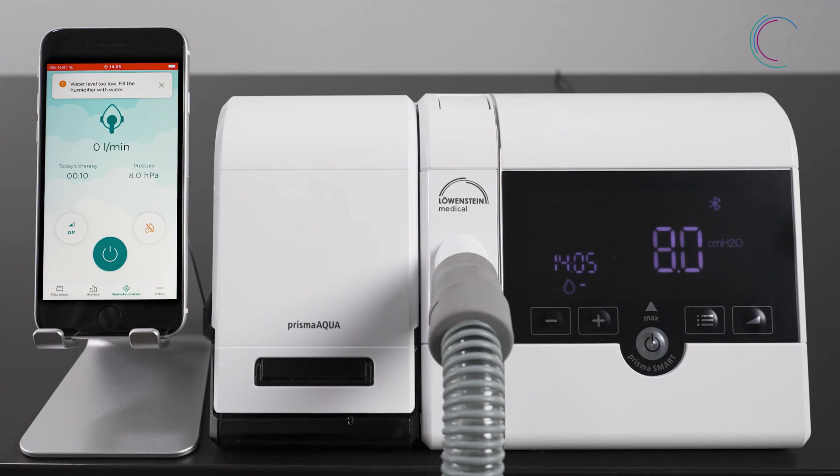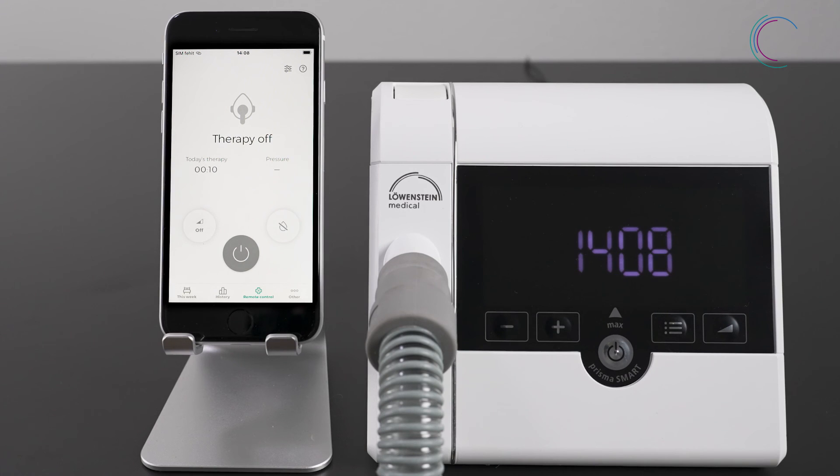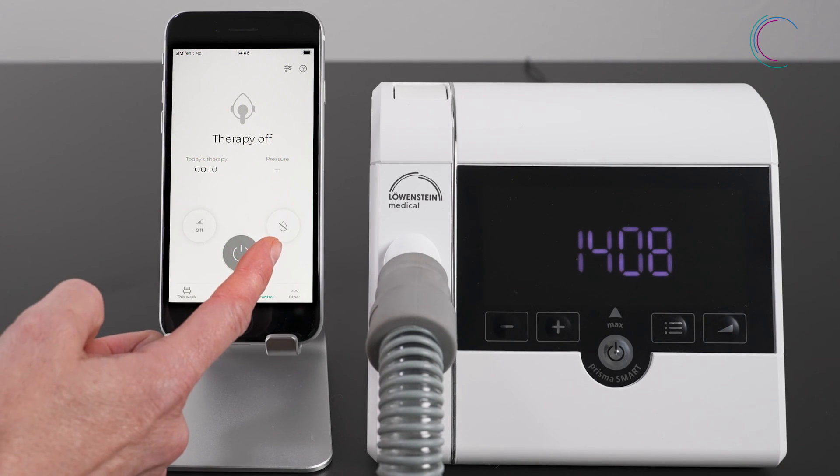If the humidifier symbol starts getting orange, Prisma aqua stops automatically — please refill Prisma aqua. If Prisma aqua is not connected, the humidifier symbol is crossed.